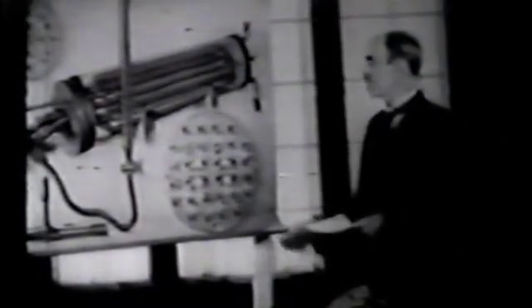The leech, when he sucks blood from an animal or a human being, keeps the blood fluid. After a leech has gorged himself with blood, if you cut him open, you find that his stomach is filled with fluid blood. So in this apparatus, the blood remains entirely fluid, and the small amount of leech substance that is mixed with the blood is non-injurious to the animal.